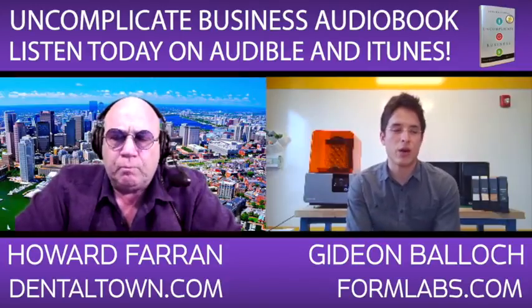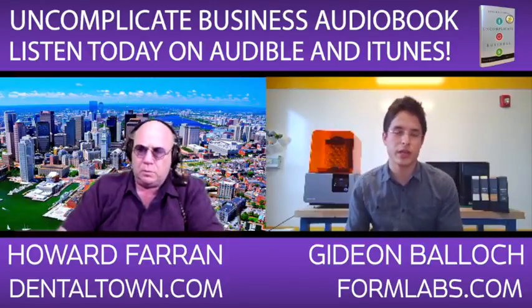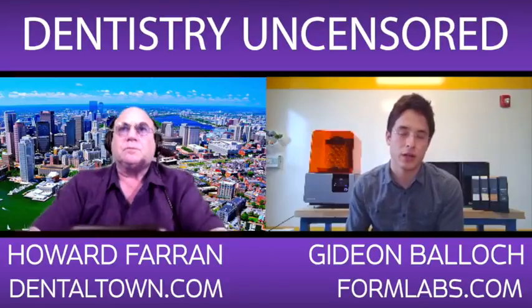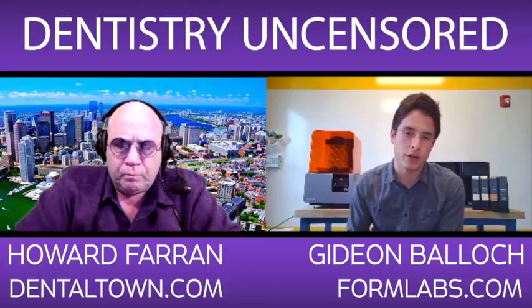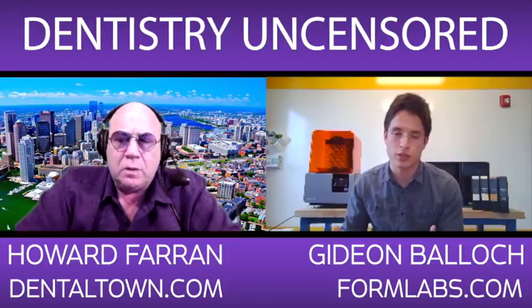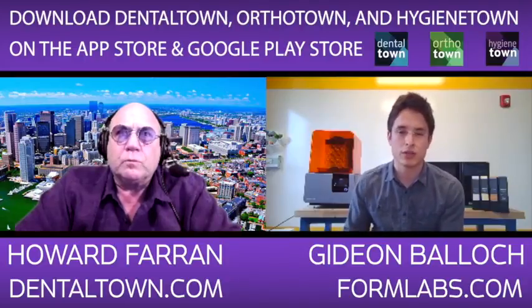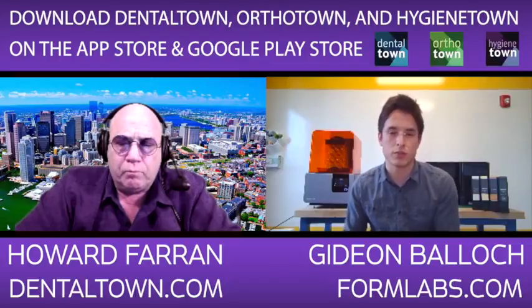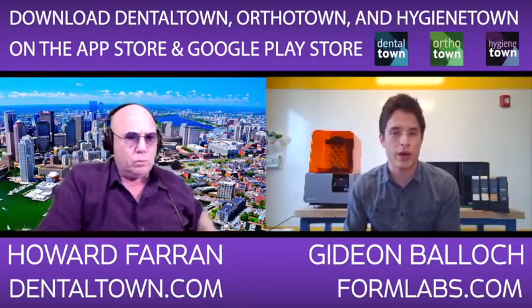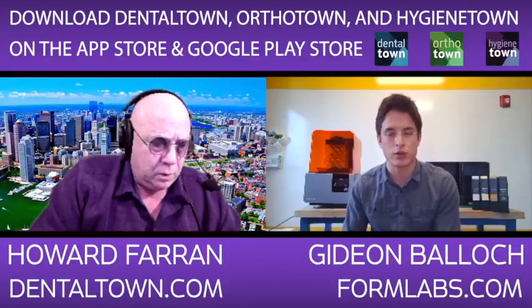So Fuse 1 is our SLS printer, SLS meaning selective laser sintering. It's a printer that takes a bed of very thin powder particles and solidifies them using a laser before rolling another very thin layer of particles on top of that layer to print again. So rather than having a liquid photopolymer like we do with the Form 2 and making a solid out of that liquid, we're taking powder and then making solid out of that powder. It was announced last year, and it's really the first major low-cost SLS printer. There's been a little bit of interest in the dental world in whether that might be something that could be taken advantage of, but right now it's mostly focused on other industries. So right now in dental, we're mostly focused on stereolithography.